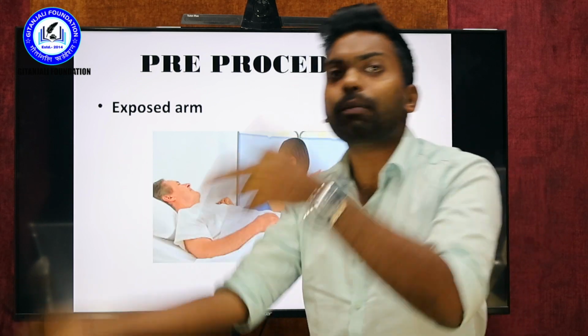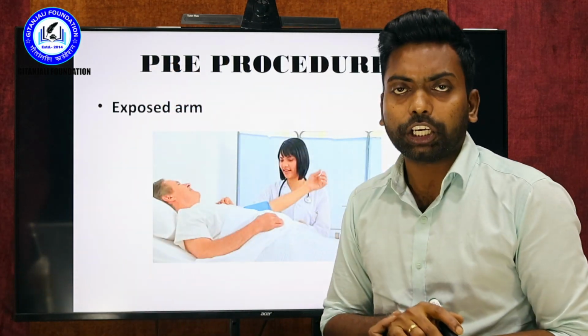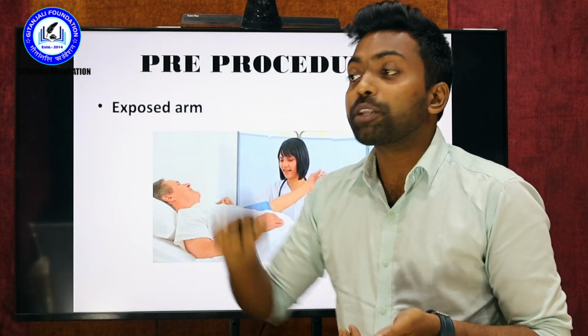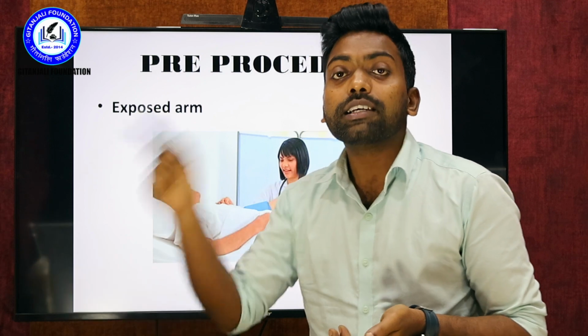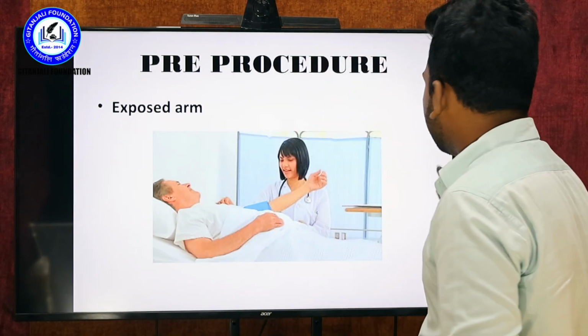As I said in the last session, there are other sites for blood pressure checking, and you can go for those. For that purpose, before you check the blood pressure, make sure you expose the particular site. That is very important.